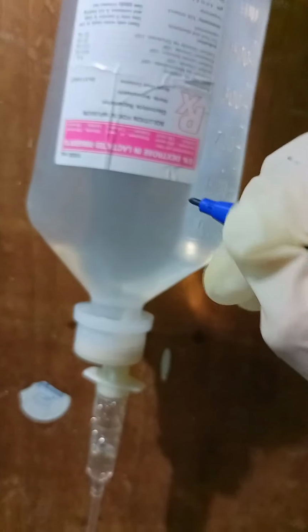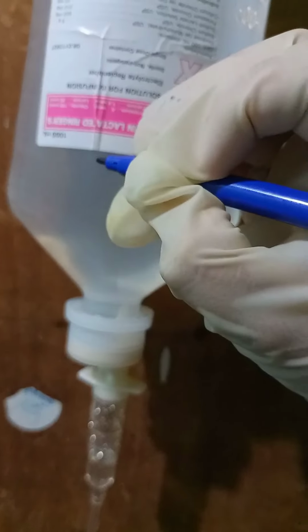Write on the IV label the date and time of insertion.